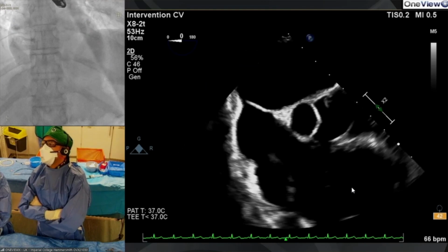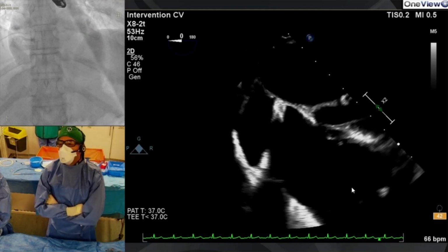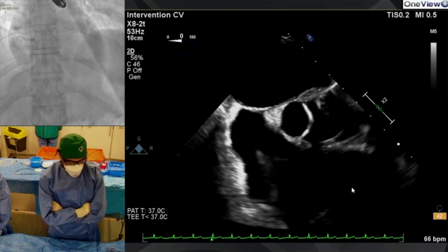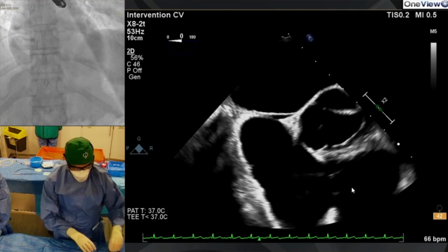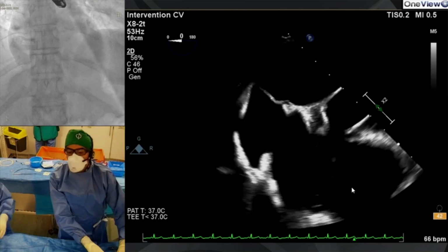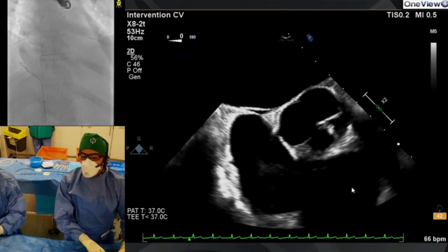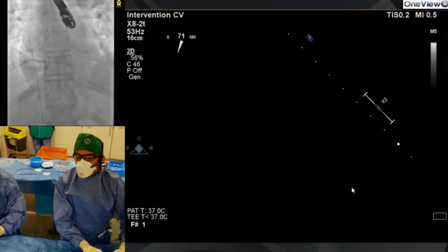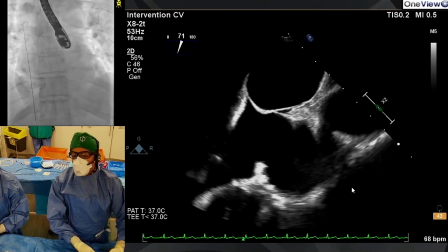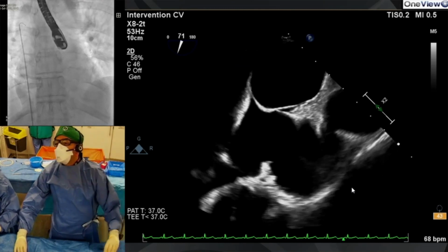Can you see that I'm scrolling down, pushing down from 0, high, and all the way down at the transverse plane, straight down to the inferior septum. And you can see that the septum looks aneurysmal. You can see that there is a PFO opening, but it looks like potentially there's quite a lot of overlap. So just doing our checks, where now it's roughly the aortic rim area, and you can see the PFO is directed towards the aorta there.